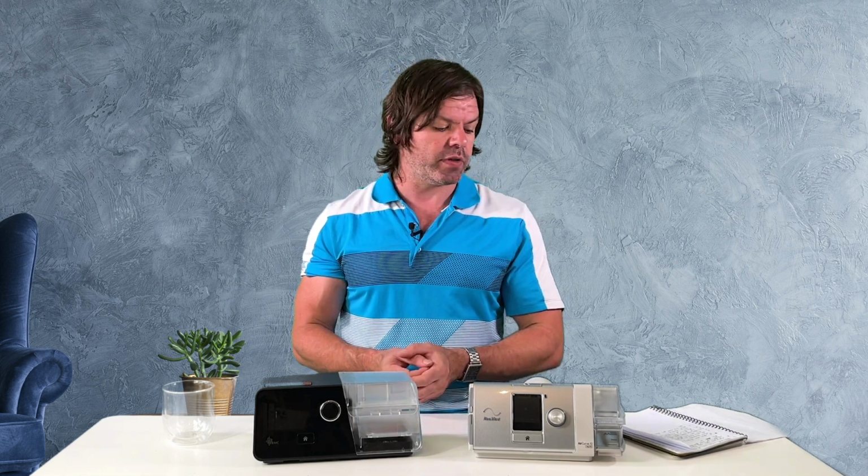Number 3, will you provide a receipt with ABN? So an Australian business number, or any business number if you're in another country. Just make sure it's a proper business, and they'll provide you with a receipt with that business number on there, especially because a lot of the health insurance companies need that in order for you to claim. They need that ABN, and they generally need that physical shop front location as well. So just make sure you've got that there.